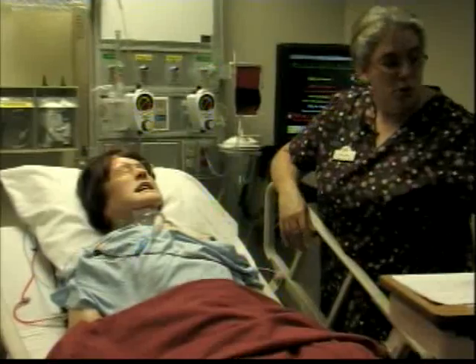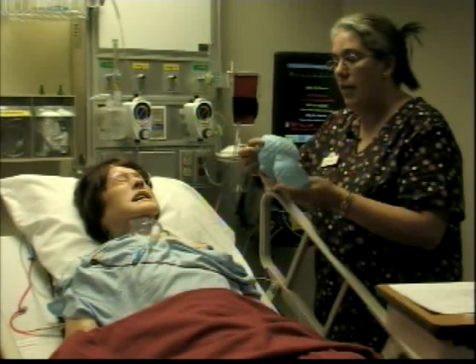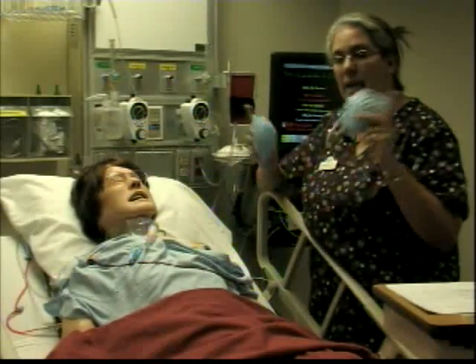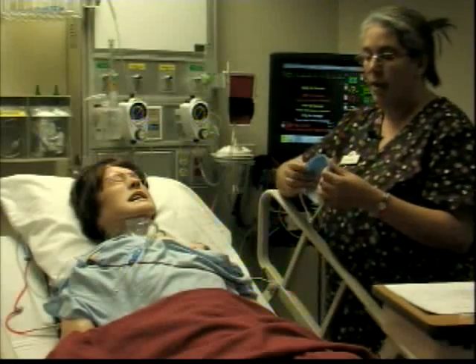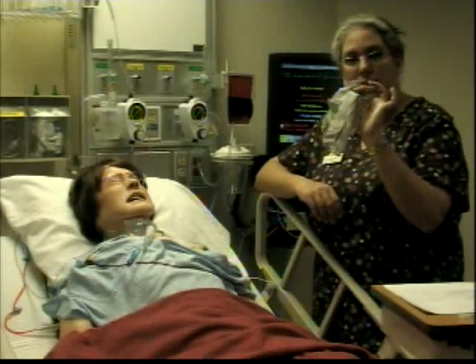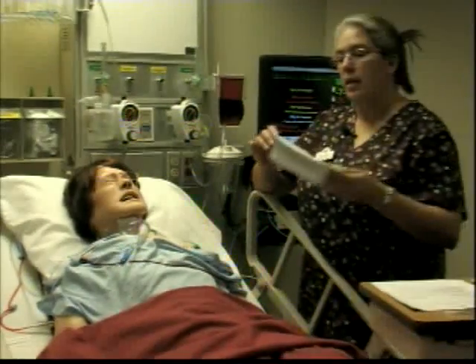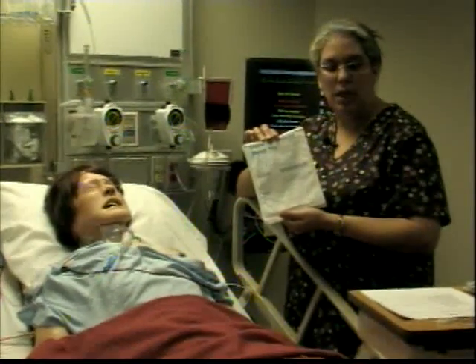So therefore, you want to make sure that you have masks with you. The important thing is that your client has to have a mask, you have to have a mask, and everybody in the room that stays has to have a mask as well. And that is for infection control purposes. You will need a pair of clean gloves to remove the old dressing, and then you need your central line dressing tray, and that's going to have everything that you need in here.